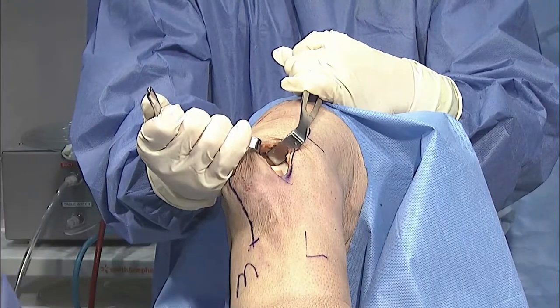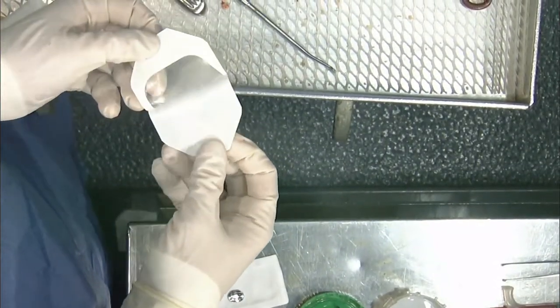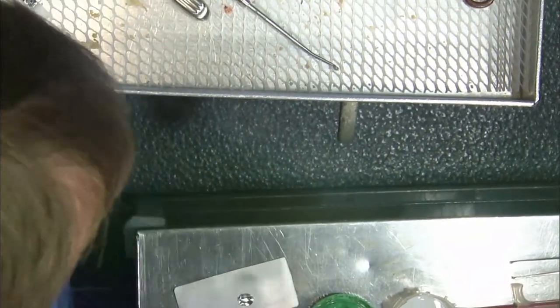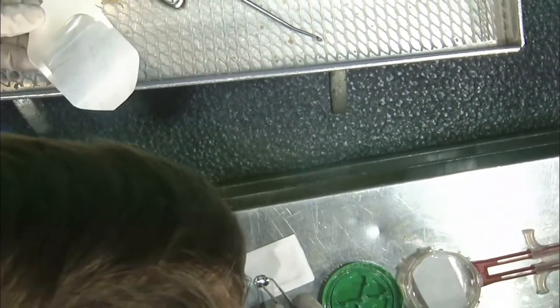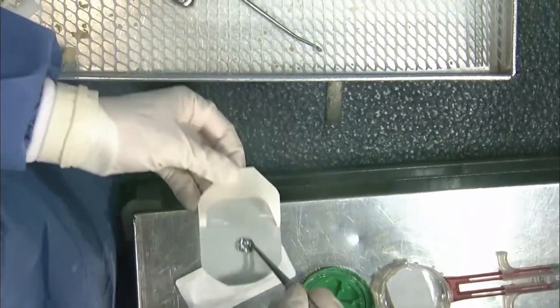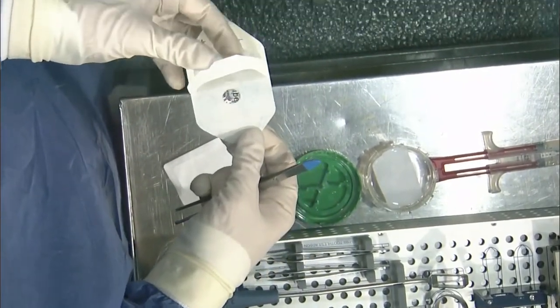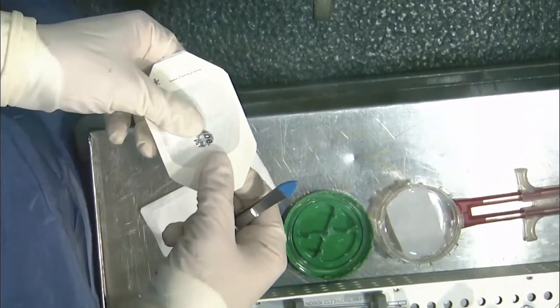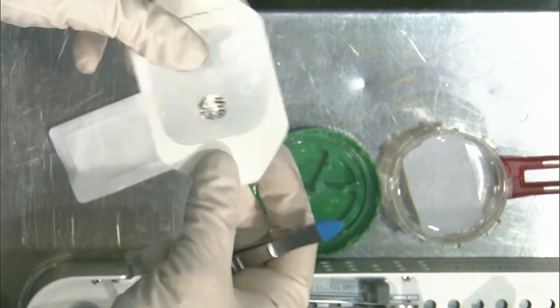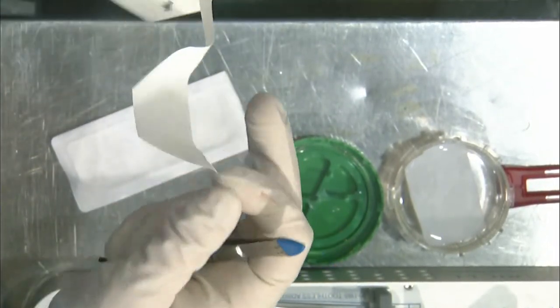Lee, why don't we come over here? So then peel the sticky part off, lay the foil in the middle of that. Don't take it all the way off. And then close it back down, and then you'll basically lay the implant on top of that and cut around it. We'll try something new. So like this? Yep, exactly. And then, again, writing is up, so I know my cell side is up, and I keep repeating this to myself and everyone around us. So like this here? Yeah, then you can take off that white part there, and now you're all set to lay the MACI on top of it. Okay.